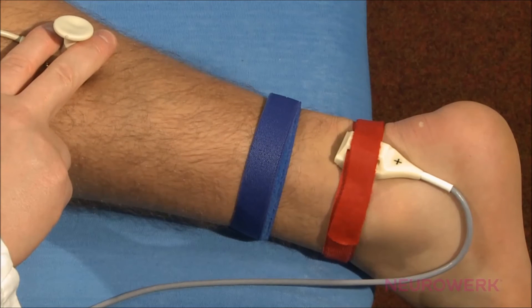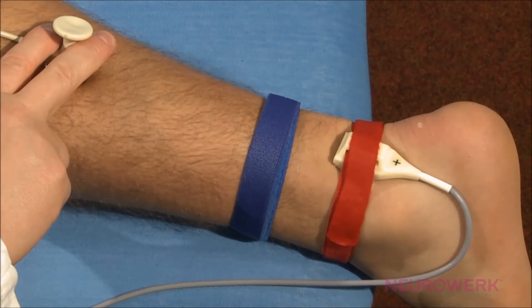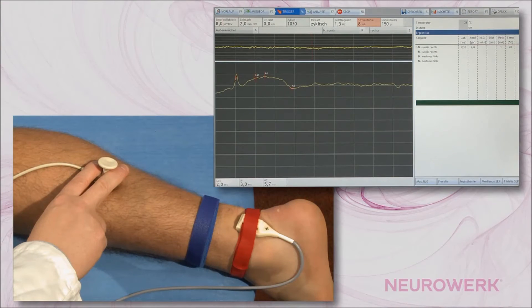Alternatively, a bar electrode can be used for recording. The stimulation intensity increases by repeated stimulation triggering until a clear response potential is shown.